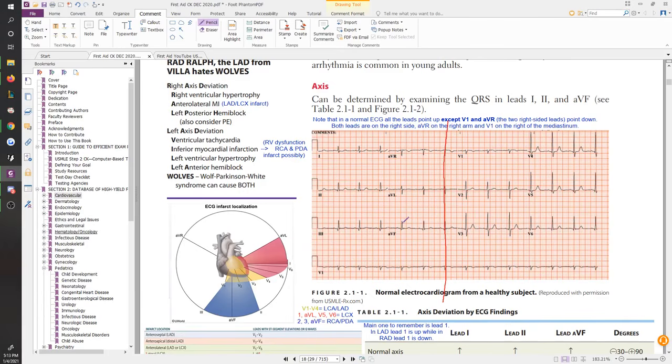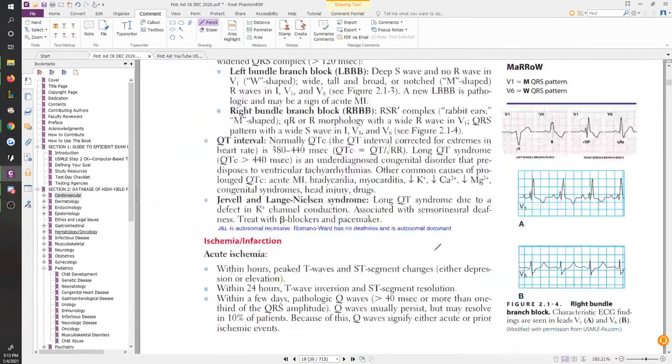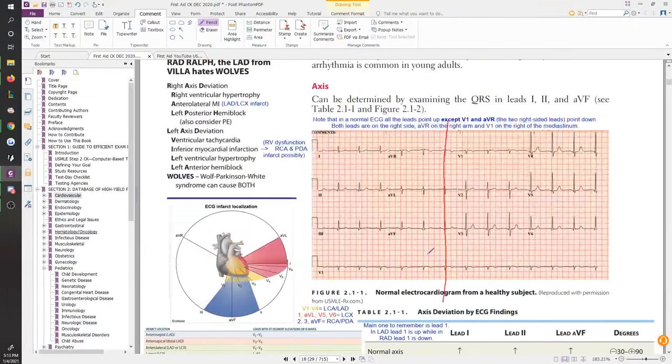And one of the quickest things you're going to want to make sure you glance over really quickly is something called the R wave progression. Right, so R wave progression. R wave progression is something that's going to be discussed pretty soon. It's coming up. But when we get to that, you'll see it. But right here, I can show you what R wave progression is. So R wave progression obviously refers to the R of your QRS.